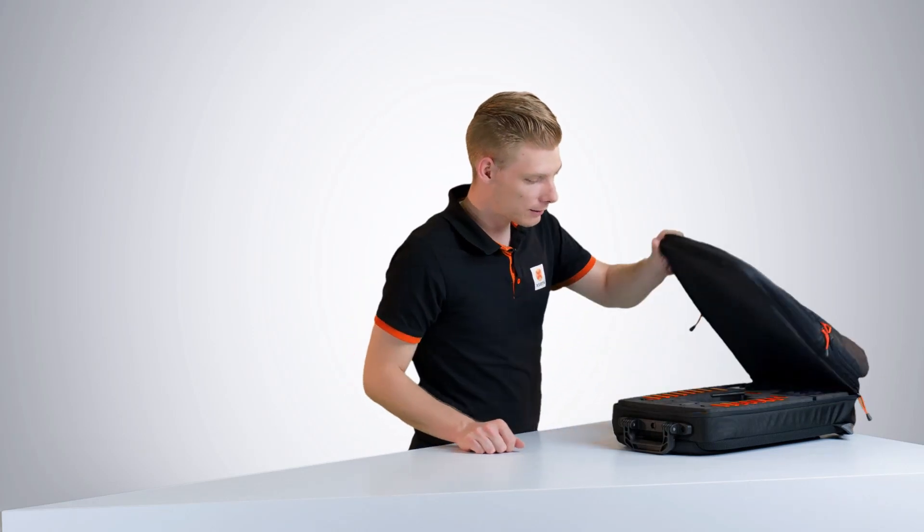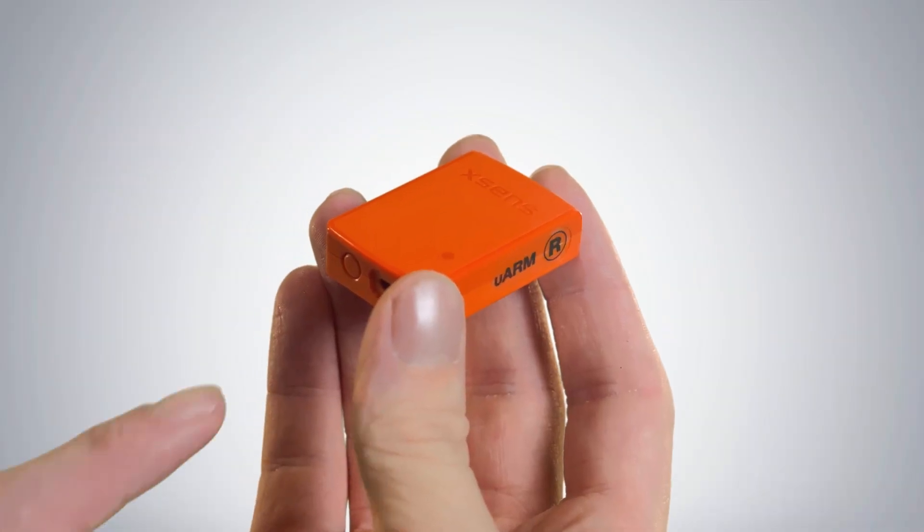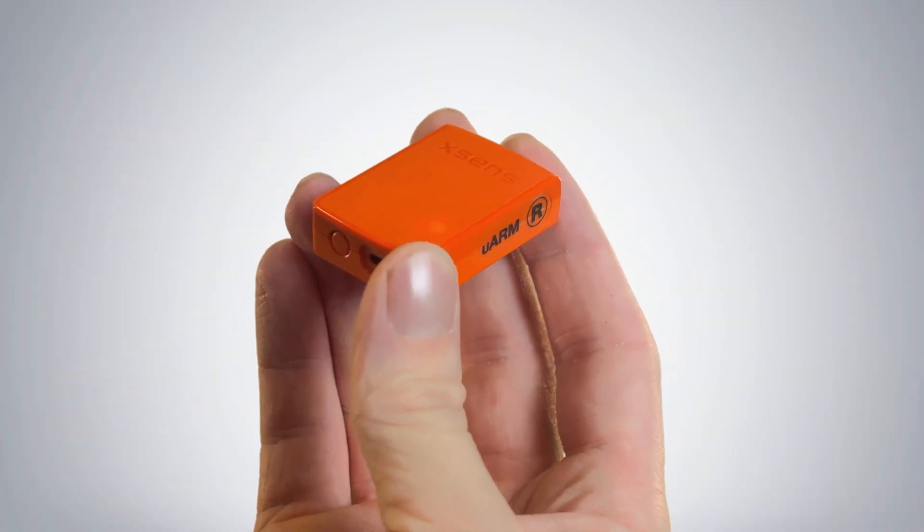With the straps prepared, let's stick on the wireless motion trackers. To power on the motion trackers, press the button and wait for the light to start blinking.